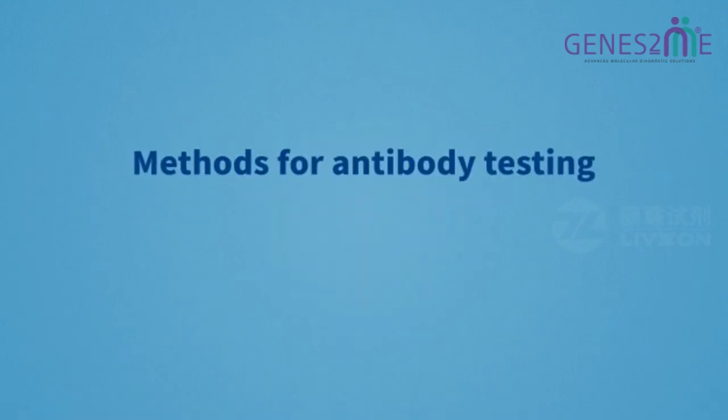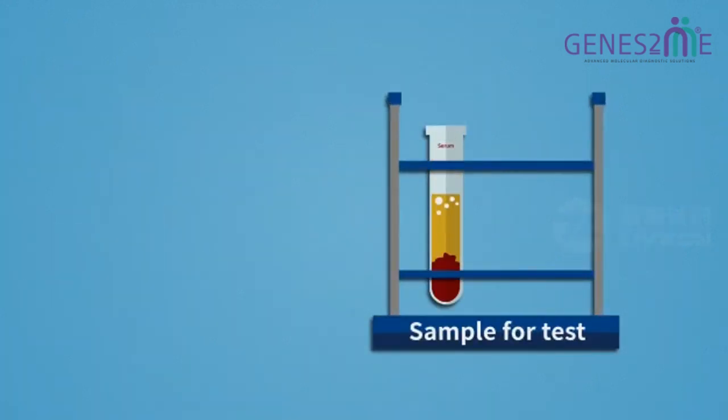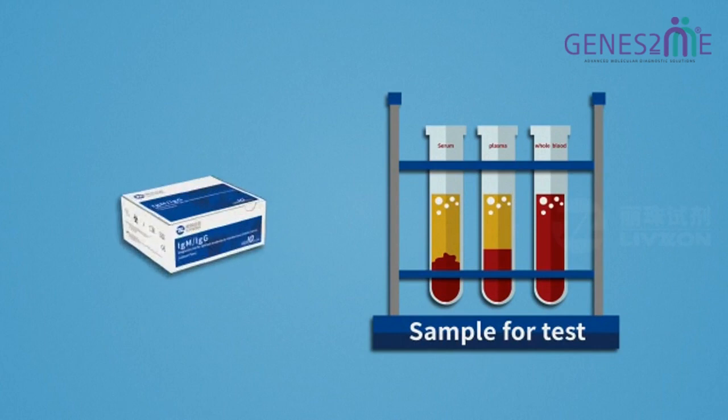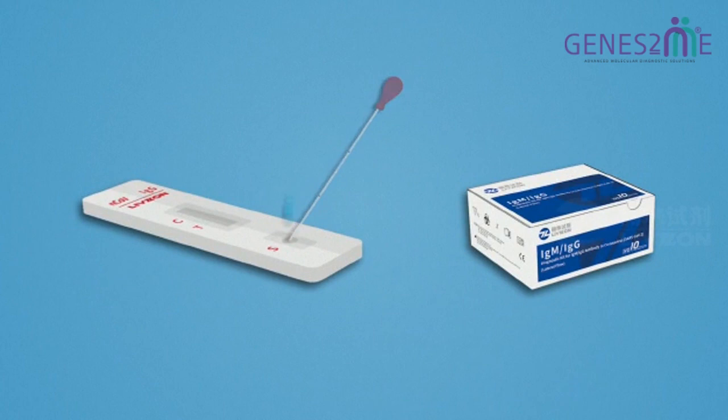Lateral flow immunoassay is the most simple, rapid, and easy-to-use method for antibody testing. Serum, plasma, or whole blood can be used as a sample for Livzon's test kit. Simple test procedure is adding sample and diluent. Result can be visually viewed after 15 minutes.